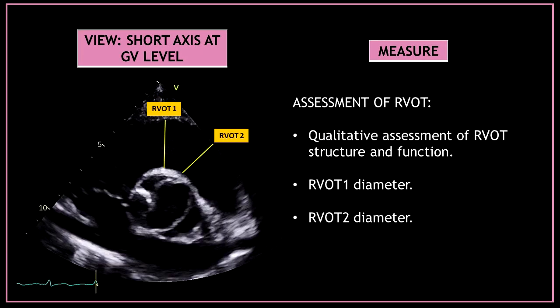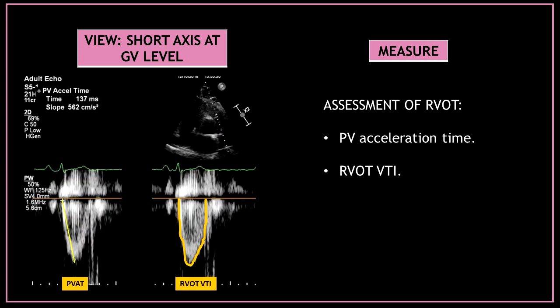Now let's assess the right ventricular outflow tract. At this level you can visually assess the RVOT structure and function and also measure the RVOT 1 and RVOT 2 diameters. Using pulse wave Doppler at the right ventricular outflow tract, you can obtain the pulmonary velocity acceleration time and the right ventricular outflow tract VTI.